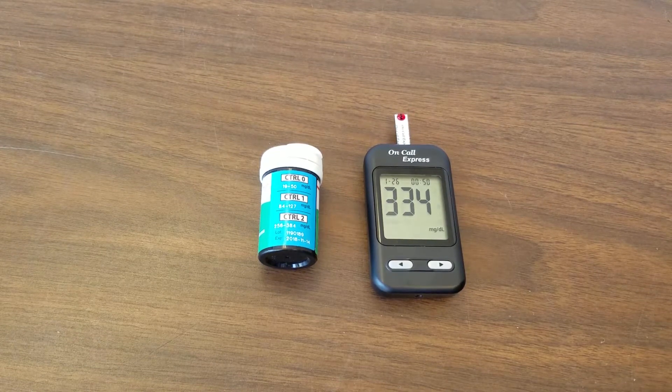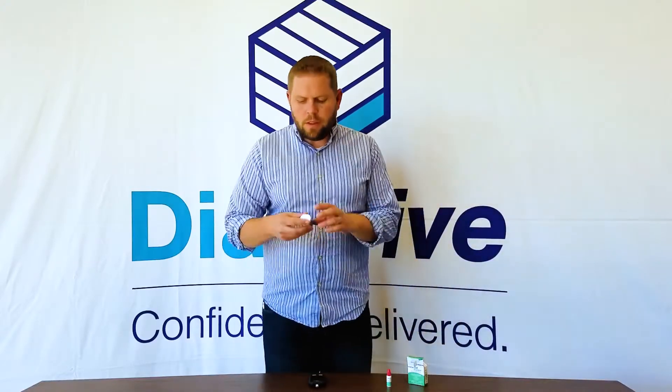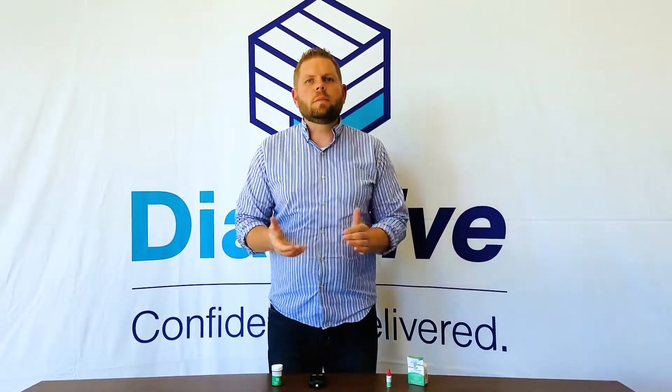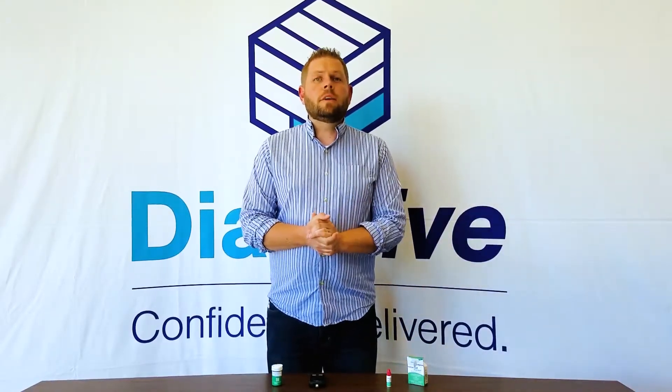So we're waiting for that reading, and the reading should fall right within the range, which is plus or minus twenty percent of what the reading is supposed to be. That's the FDA regulation that tells me that my strips are still good and that they're accurate.